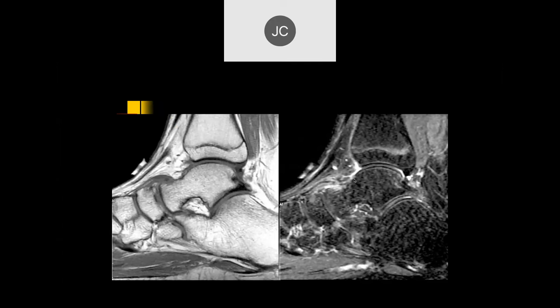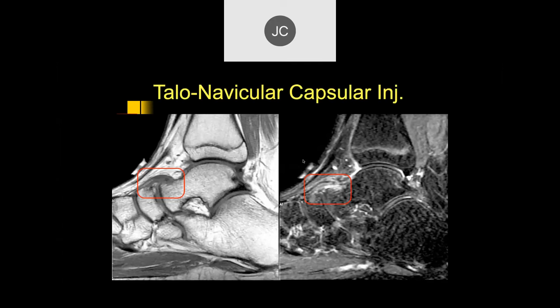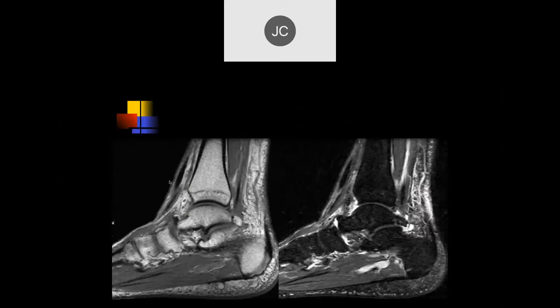Here we're looking at the dorsal talonavicular joint. I see thickening of that capsule and dorsal spurs. As you've seen over and over again, in most adults — especially older individuals — you'll find degenerative changes involving the dorsal talonavicular joint. You can also see this in teenage athletes. It's a very common area of repetitive traumatic injury and a common cause of dorsal pain overlying the anterior ankle and foot.